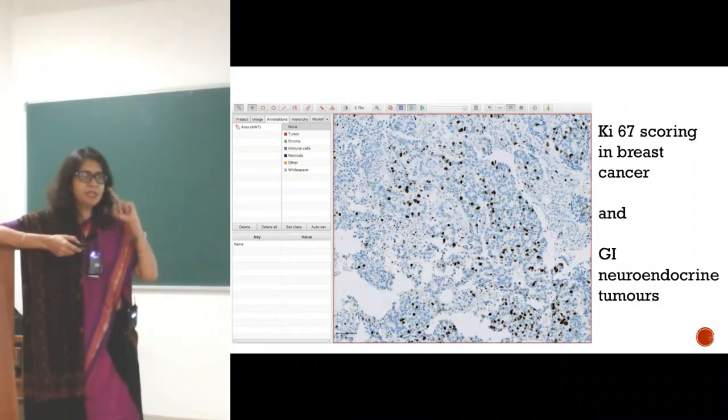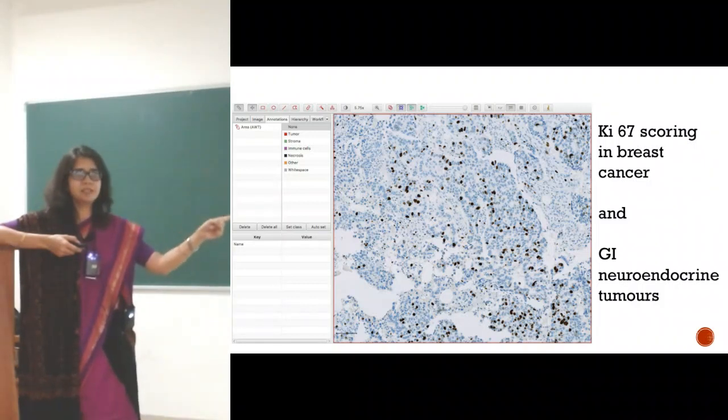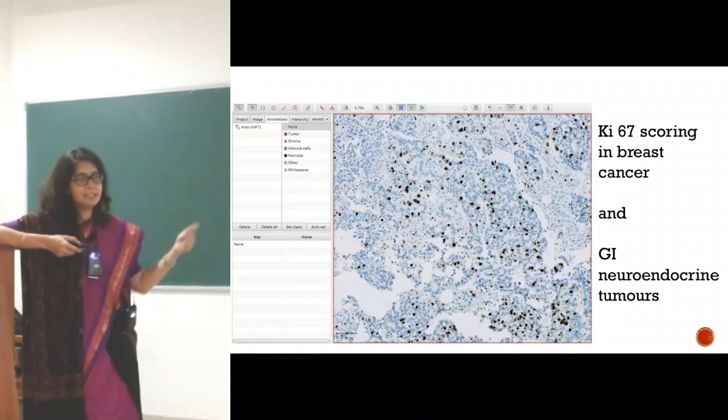The human brain can tell that this is a blood vessel cell, or this is a tumor cell, or this is an inflammatory cell. The computer makes mistakes. So that is why you have to validate your algorithm. Just having an algorithm is not an answer. And that validation is the most challenging part of computational pathology, which is why it's not there yet, and why there has to be a close interaction with the pathologist to fine-tune your algorithms.